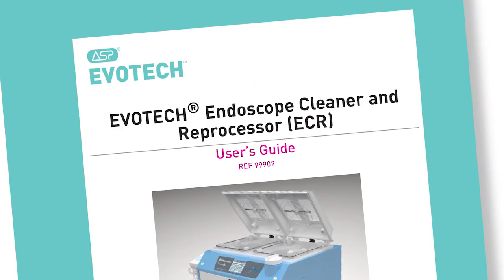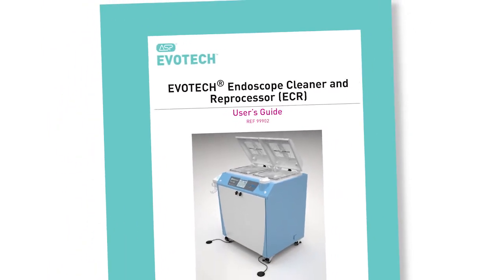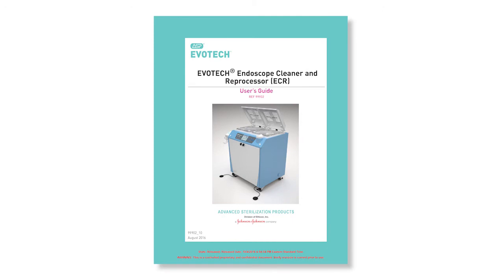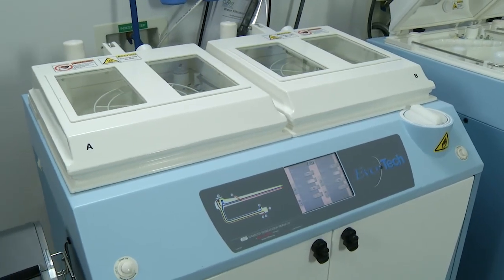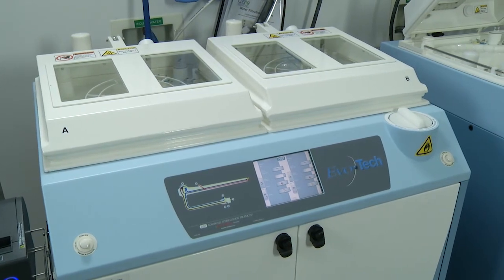Each EVOTECH ECR comes with a user's guide. It is your resource for every function of the EVOTECH and is a manual that all employees using an EVOTECH ECR should be familiar with. This manual should be immediately available to all staff in the reprocessing room. All employees using the EVOTECH ECR should have thorough initial training and ongoing competencies.